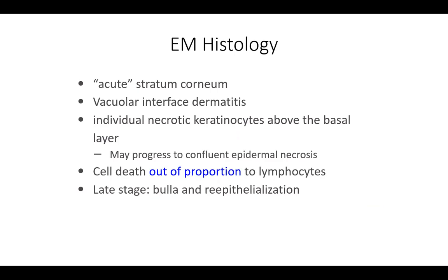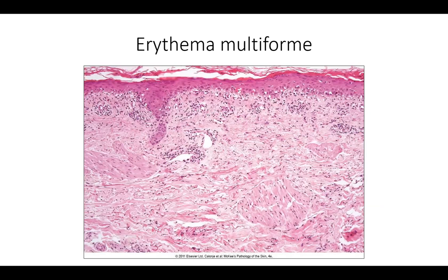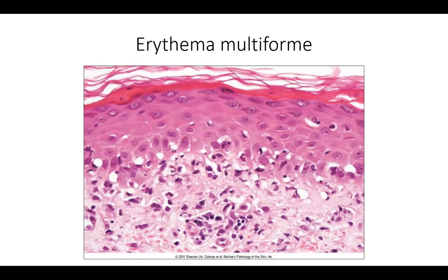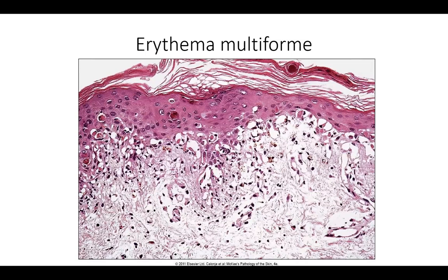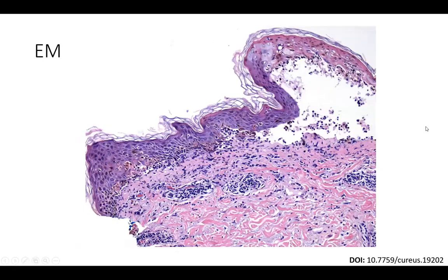On histology for erythema multiforme, you see confluent basal-vacuolar interface change, scattered dyskeratotic keratinocytes, and an acute basket-weave stratum corneum suggesting an acute process. There are more examples of basal vacuolar change with scattered dyskeratotic cells. In some cases there is more epidermal degeneration, and you can see a gradient from the outer to the inner edge where interface and dyskeratosis progress to even more epidermal necrosis, possibly lifting off like a bullous erythema multiforme with near full-thickness necrosis at the center.